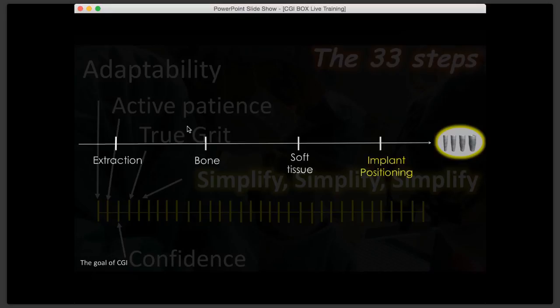So the best I can advise you right now is don't look for any shortcuts. Either take an impression of the patient's teeth, meaning an optical scan, or take a PVS impression. Okay, so it'll cost you $15 for the impression material, but you'll get an accurate impression that you can then digitize. Okay, when I say you, that you will have digitized, you don't have to do it yourself.